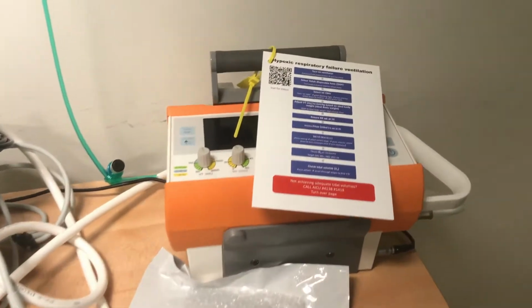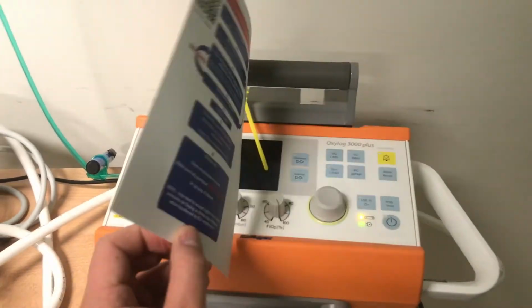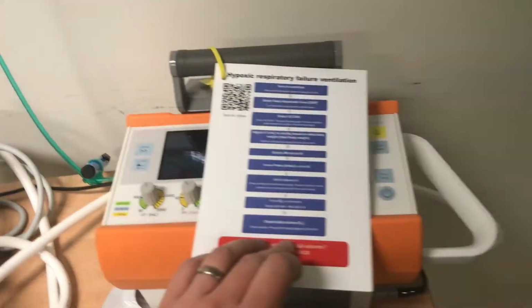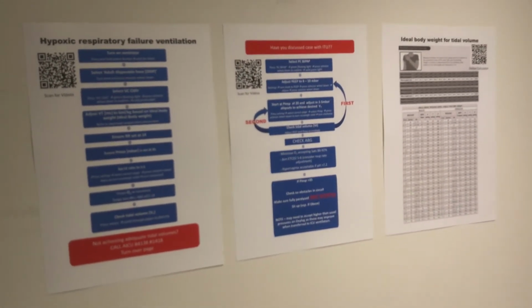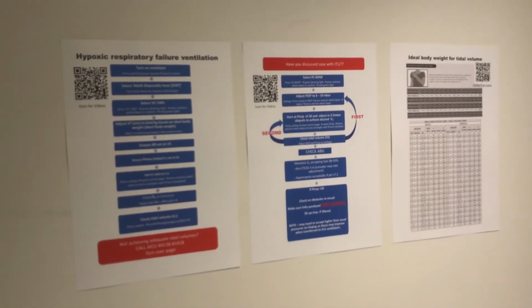The other thing we've done in each of the resus rooms is put a laminated flow sheet to help people with the ventilation settings when setting up to ventilate a patient suffering with COVID. They're attached to each of the ventilators, and then we've also got them on the walls, including a weight conversion chart on the end of here. There's a related video if you wanted to watch that, starring Jazz.